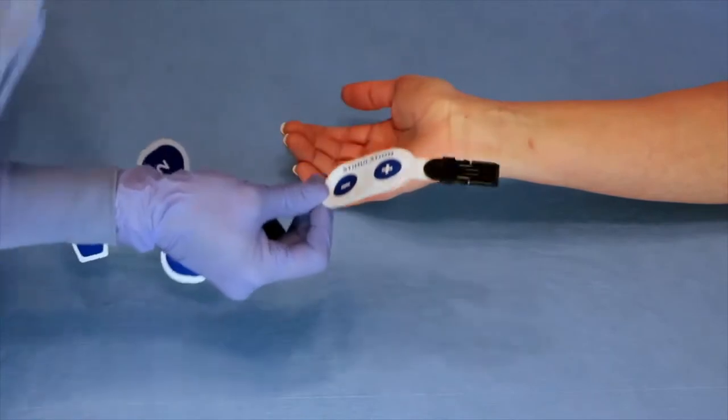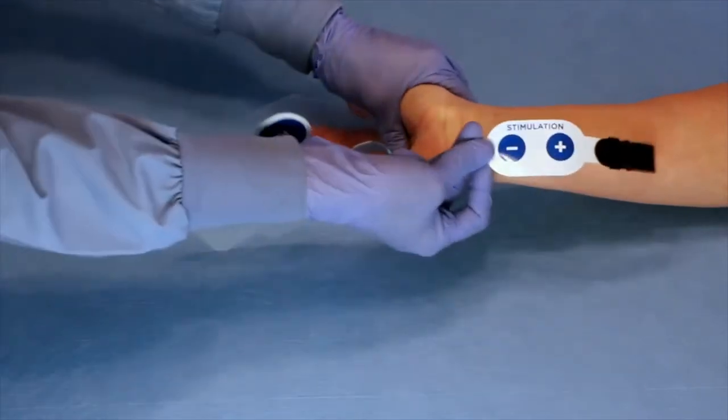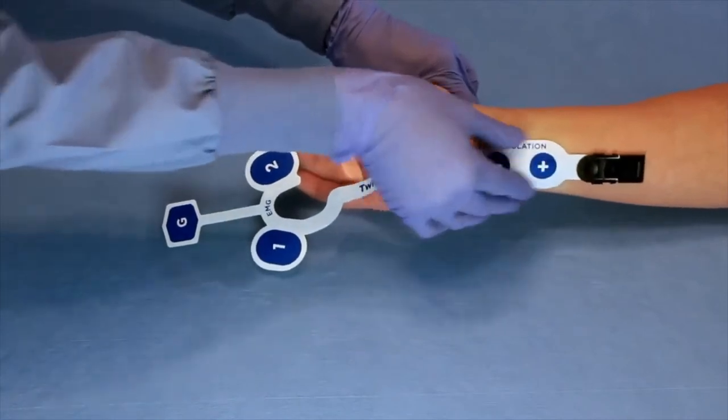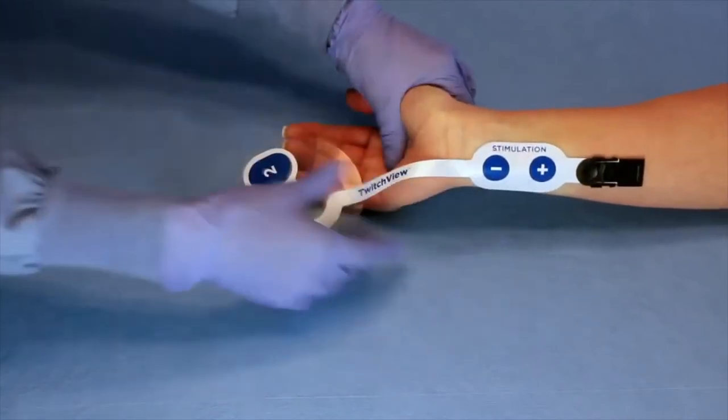Place the stimulating electrodes directly over the groove just proximal to the wrist crease. Press down firmly to ensure adhesion.